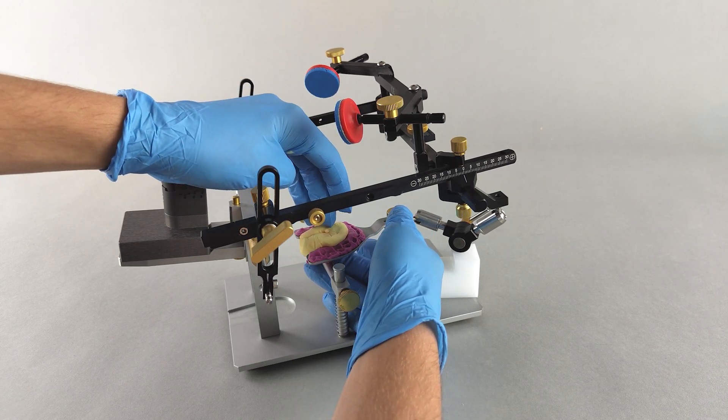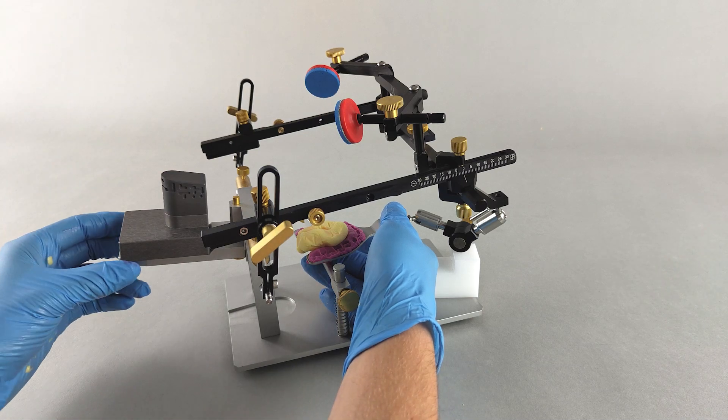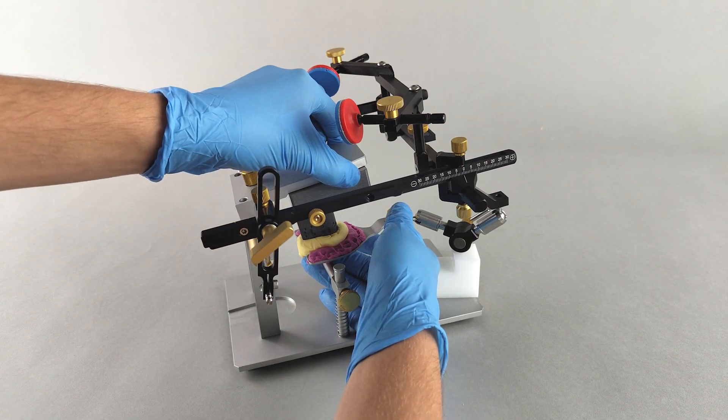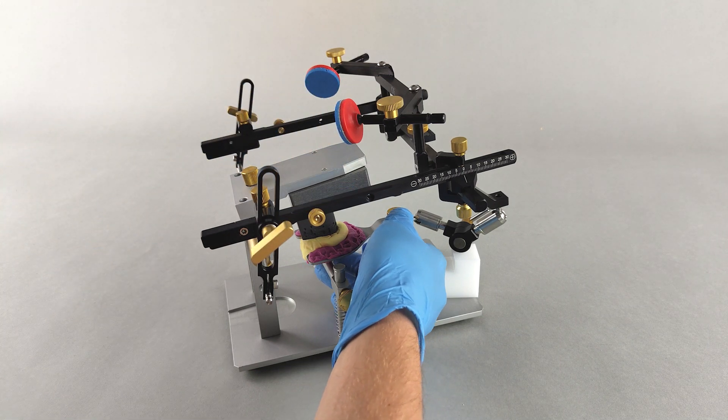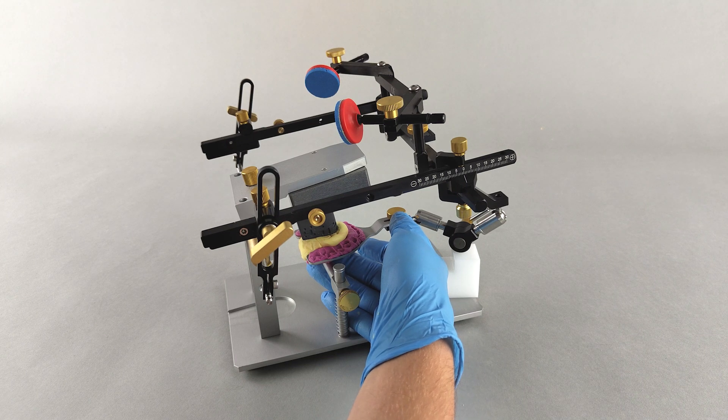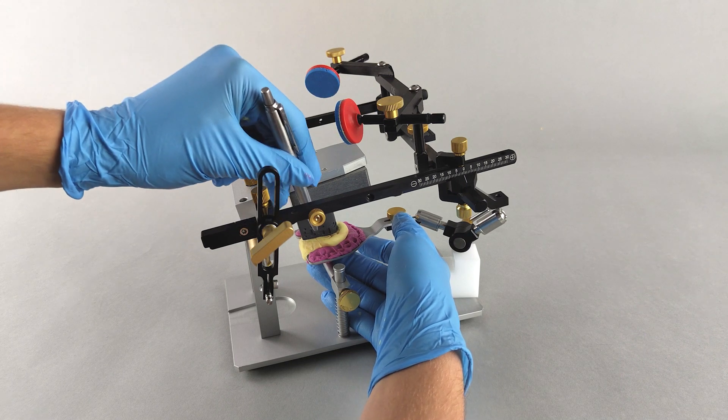Make sure not to fill in any of the upper jaw impressions. Close the transfer stand. Support the putty material from below to ensure that it adheres to the underside of the transfer block. Make sure that no material enters the reference pattern of the block.